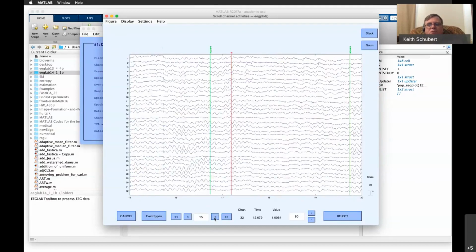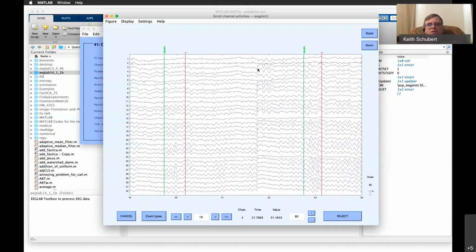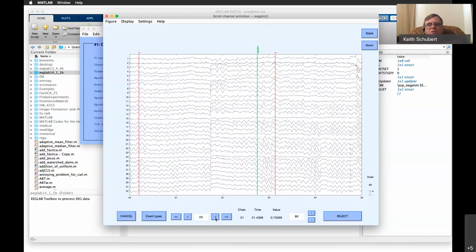It's pretty smooth. Usually blink artifacts tend to be bigger bumps. You can see a little bit of a discontinuity here, which tells us there's some things to clean up. And you can again see, here's my stimulus and here's my response. You can see some very characteristic waves that are going in. But like these discontinuities, we might want to try to clean up things of that sort.